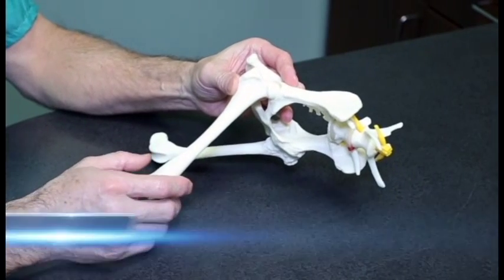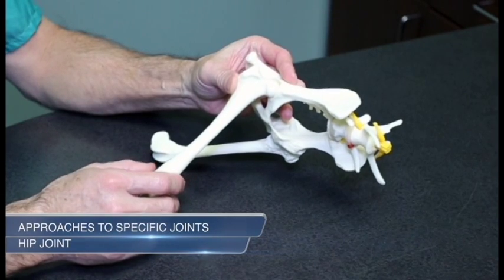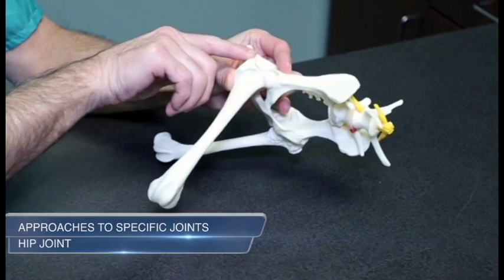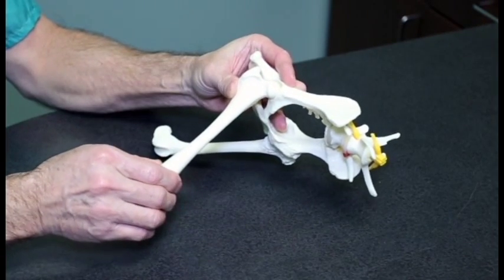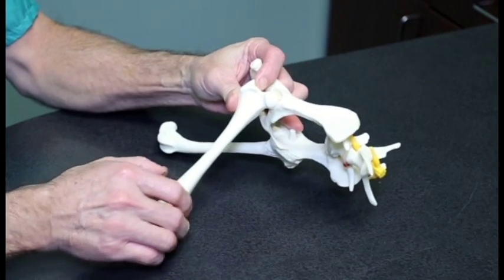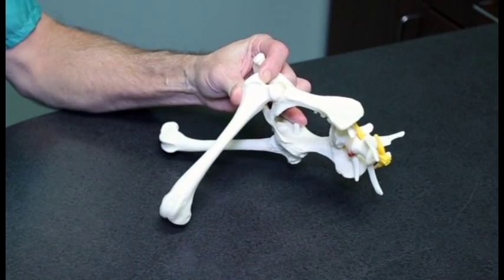Hip joint. An assistant is helpful in manipulating the limb. In a lateral approach, palpate the greater trochanter. Slightly abduct and outwardly rotate the femur. Traction of the limb may assist opening of the joint.